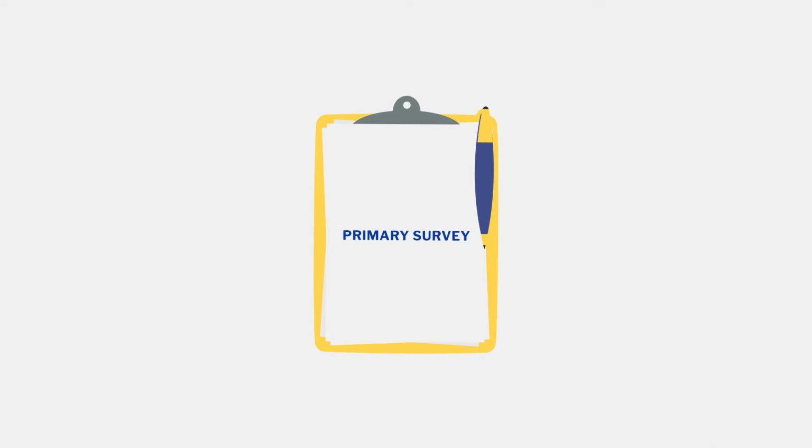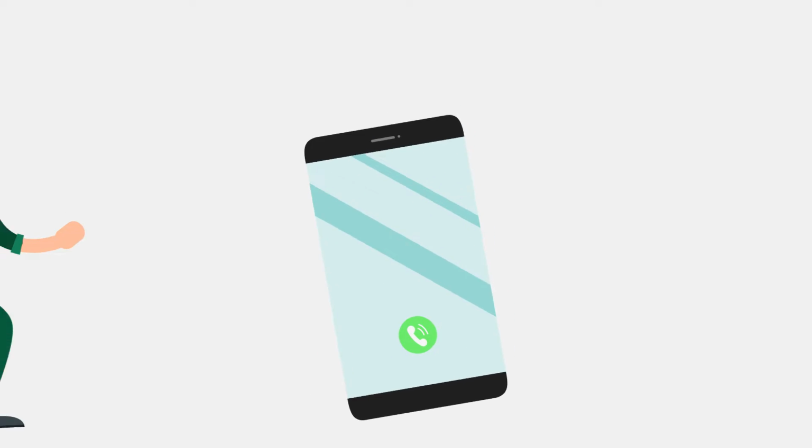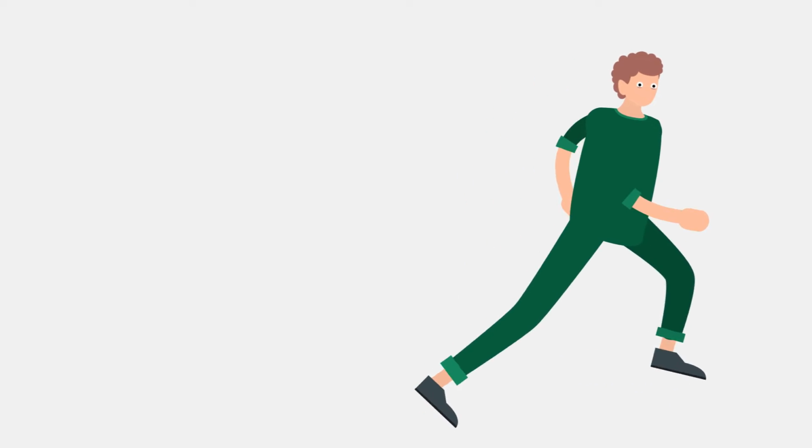How to use defibrillators. If you have found a casualty, you should first perform a primary survey and immediately call 999 or 112 from your mobile. If you are by yourself, use the hands-free speaker on your phone so that you can begin CPR. Do not leave a casualty for a defibrillator yourself. A helper should get it, or the ambulance will bring one.